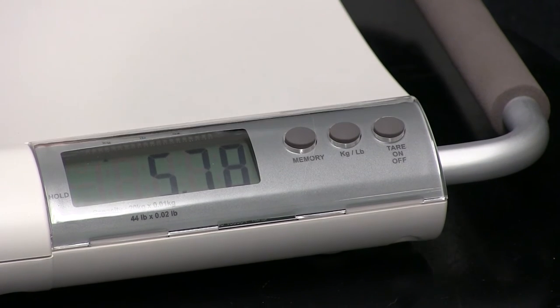The V20 also comes with a memory button. Press the button and this will bring up the last weight shown. The V20 has a capacity of 20 kilos, weighing in 10 gram increments. It also has a large LCD, making it very easy to see the weight reading.